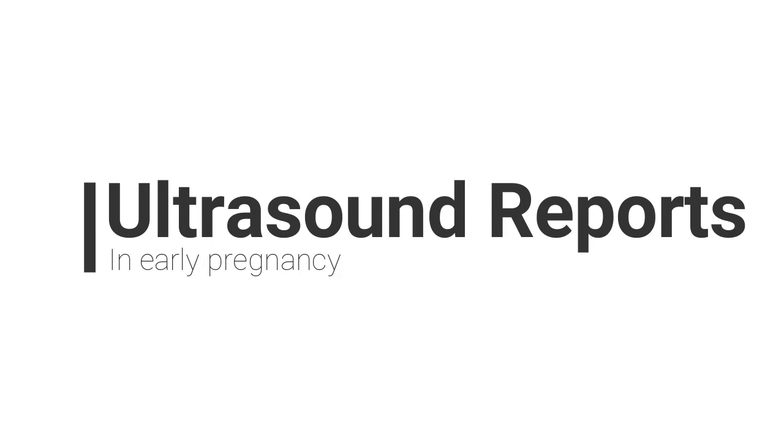This is a lecture on understanding early pregnancy ultrasound reports by me, Dr. Caroline Prentice.